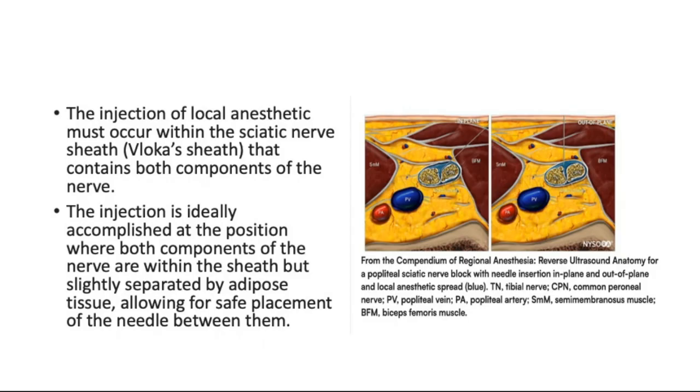I think basically these are two extremes. On one extreme, you can have the very edematous patient where everything on the image is full of water, and the other is the elderly patient with dry tissue, where everything is bright. In both situations it's quite difficult to appreciate where the nerve is. I agree there is some value in using the nerve stimulator to identify the nerve.